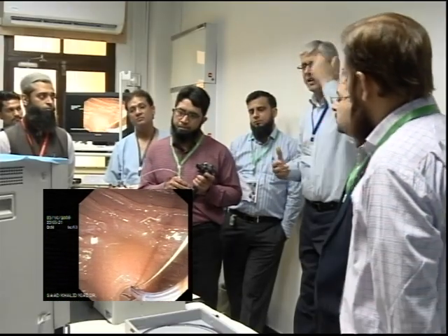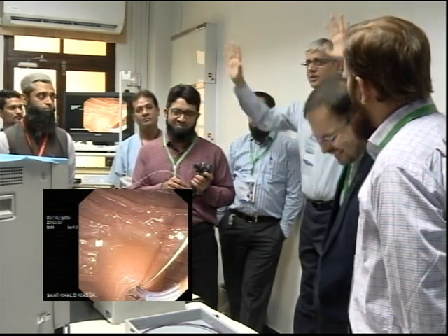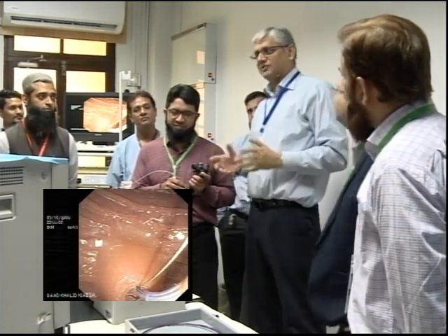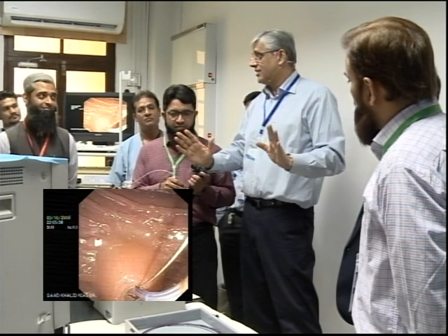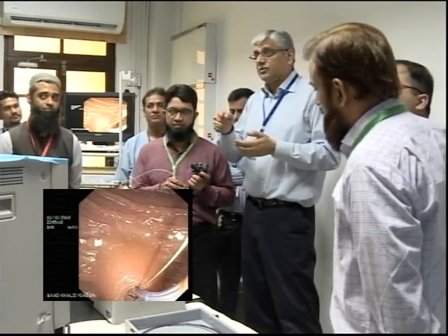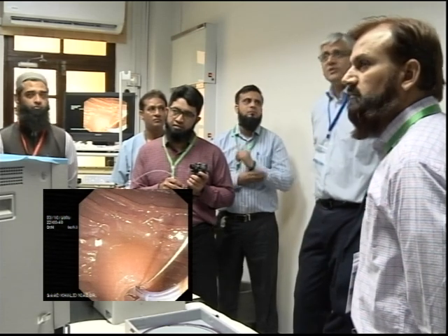Usko to nahi bata, usne kaha, in wire talk. Aapne jab nikala to usme sara parenchyma bhi uska wo ho gaya. And then you say, oh shit, pancreatitis ho gaya. Pancreatitis, this is purely, when I said, ek hota hai complication, part of the procedure, you were cannulating, everything went by the book and patient had pancreatitis, I can't help it. But for all patients, all comers, everybody know.